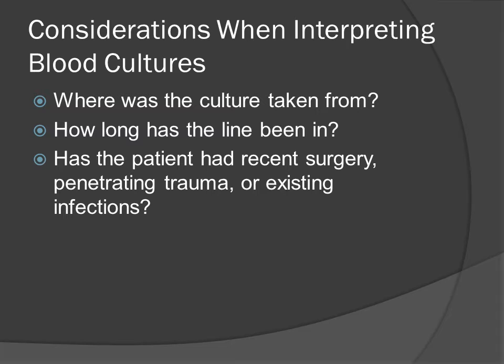A blood culture set consists of one aerobic bottle and one anaerobic bottle. Aerobic means with oxygen, anaerobic means without oxygen, because the bacteria require different conditions in order to ultimately grow and flourish. A positive single culture may not be interpretable, so you're doing two sets of cultures. If one of the two is positive, was it a sampling error? Is it a contaminant? How do you interpret that?